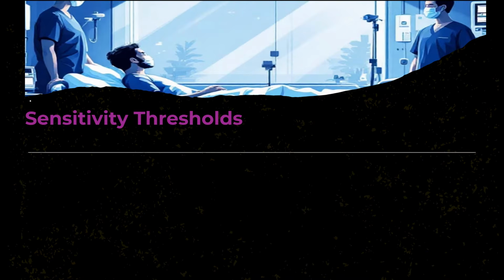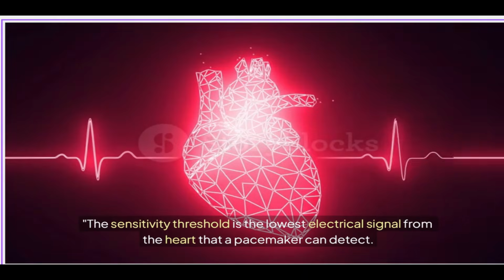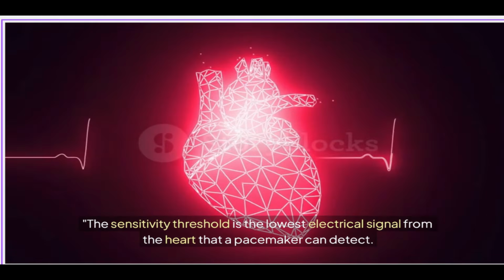Sensitivity threshold. Understanding the significance of the sensitivity threshold in the pacemaker is very important for effective cardiac monitoring and patient safety during the testing time. So what is the sensitivity threshold? It's the lowest electrical signal from the heart that the pacemaker can detect.